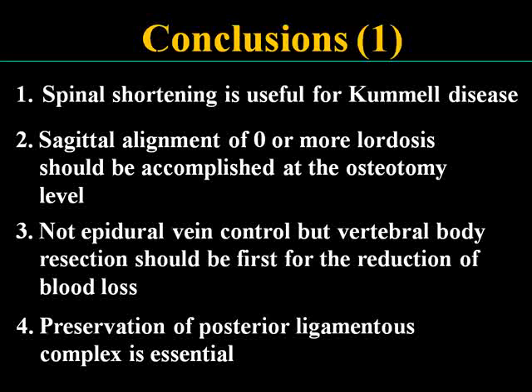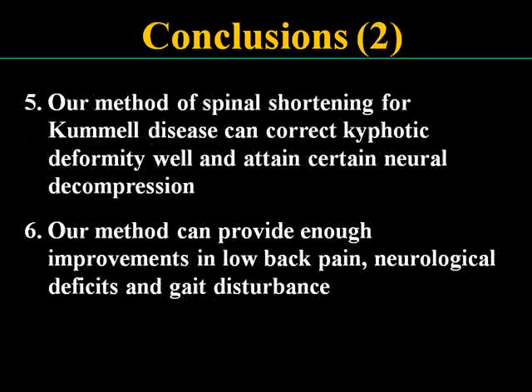Our method of spinal shortening for Kummell disease can correct kyphotic deformity well and attain certain neural decompression. Our method can provide enough improvements in low back pain, neurological deficits, and gait disturbance.